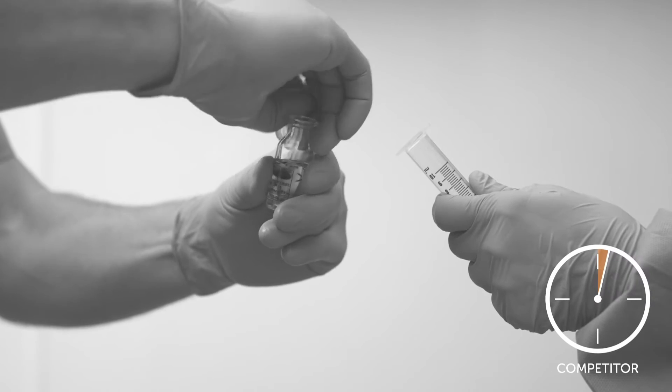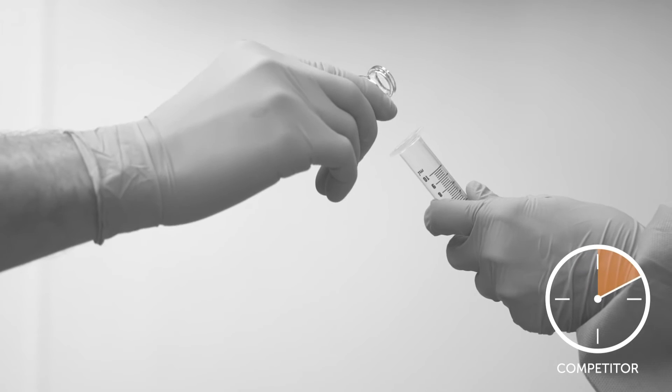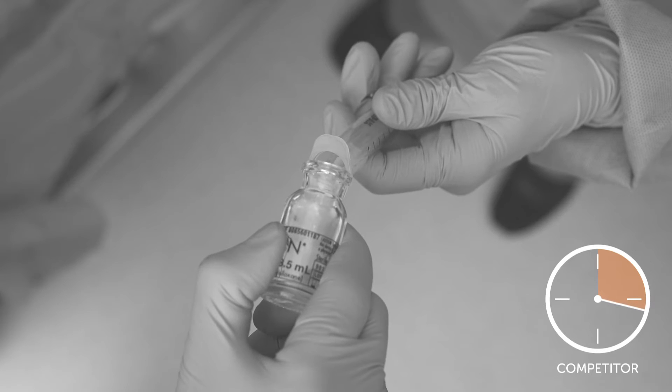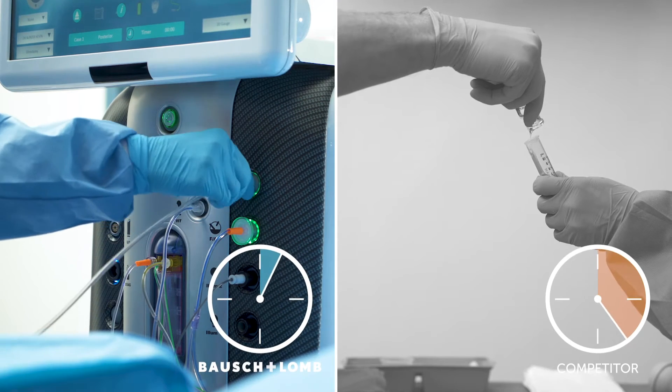Traditionally, silicone oil products have required a cumbersome hand-pour process to transfer oil into a syringe in preparation for injection into the eye. With Adato silicone oil, the sterile presentation eliminates the need for this process.